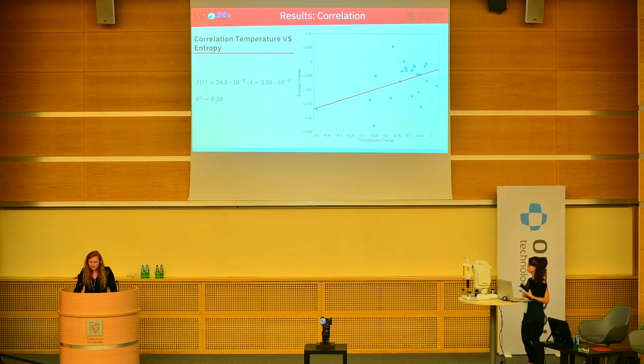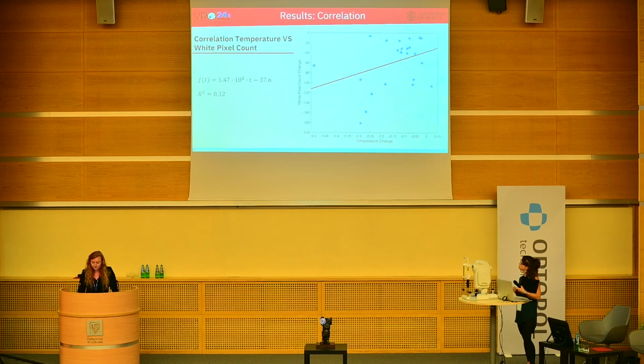While the correlation between the two channels may be low, integrating data from both channels could enhance diagnostic accuracy by providing complementary insights into different aspects of the tear film. The combination of these two channels may offer a more comprehensive understanding, leading to improved diagnostics, but further research is required to optimize this integration, which I'm currently working on in my PhD program. I meant to say the research is not closed yet. Similarly, there's also a change in white pixel count.